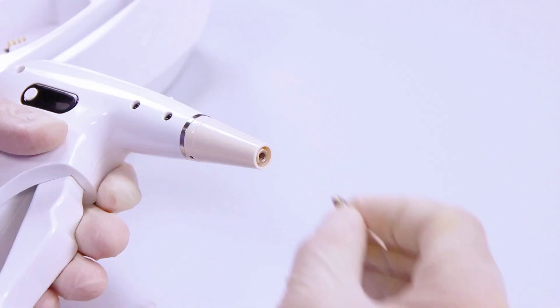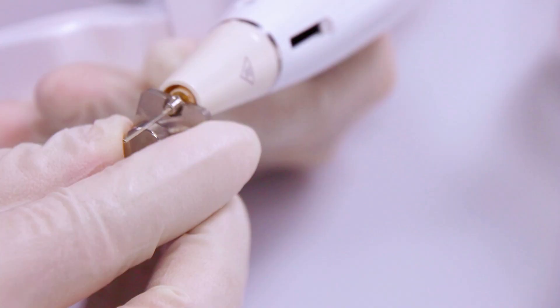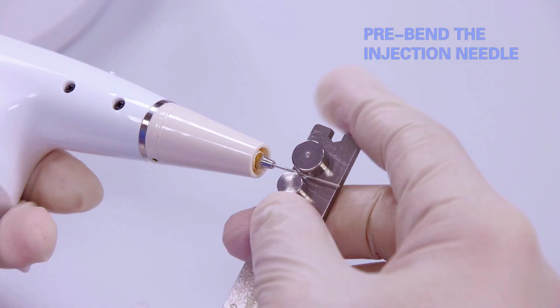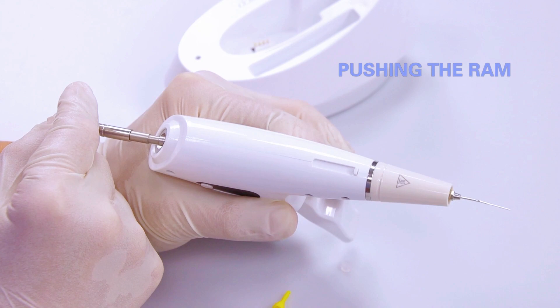Load the injection needle. Pre-bend the injection needle. Insert the gutta percha and push the ram.